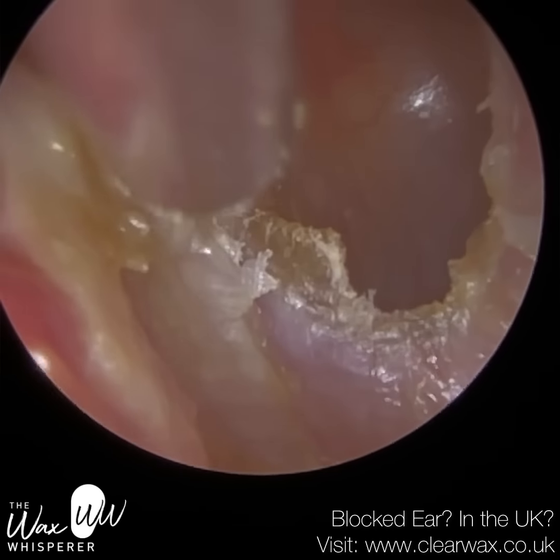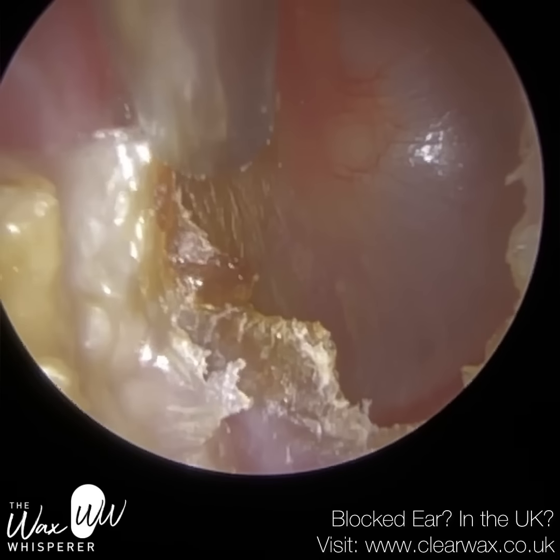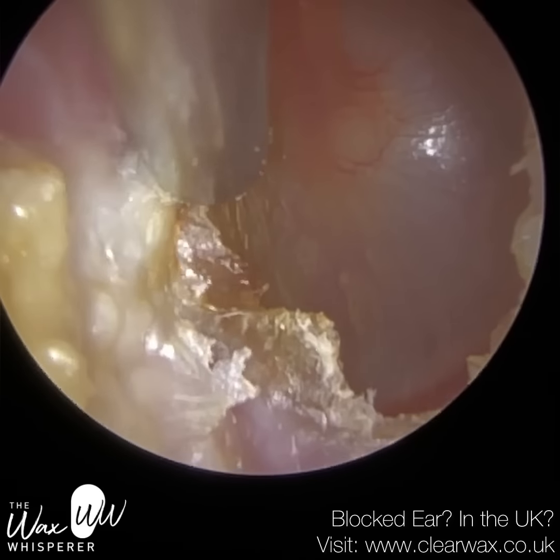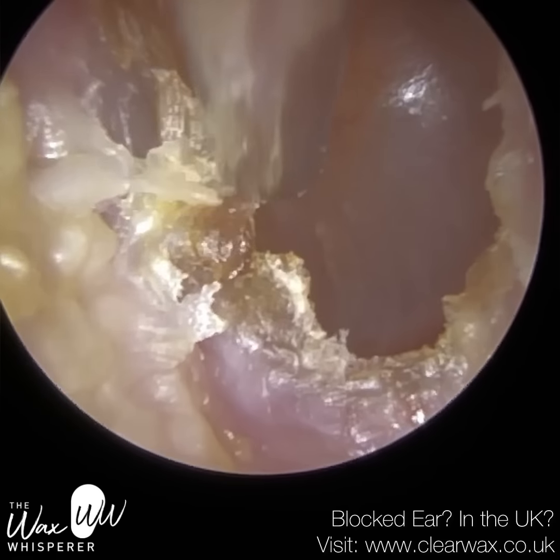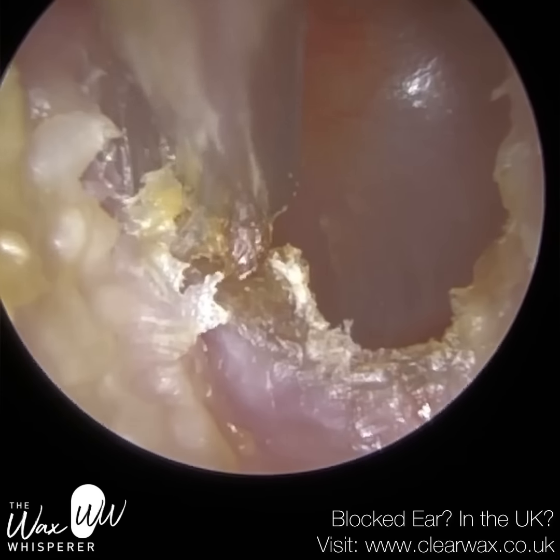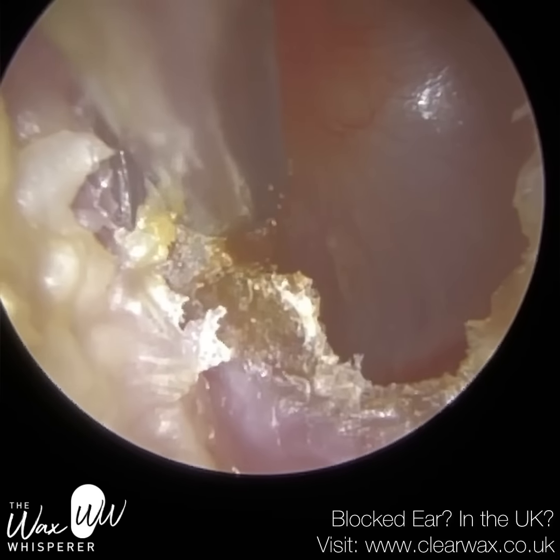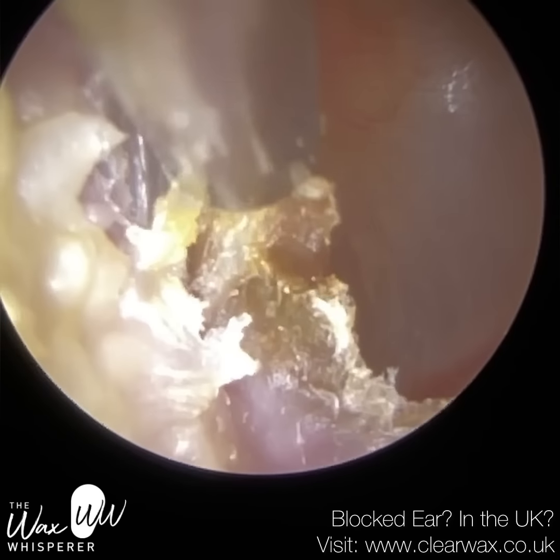In a case of a potential, if that skin was ulcerated, you'll get some discharge there. That would then be potentially a canal cholesteatoma or benign osteonecrosis. But this widening is quite global. It's more or less the southern hemisphere of the ear canal, so the south equator region. And to the left, you'll get a better view in a minute.